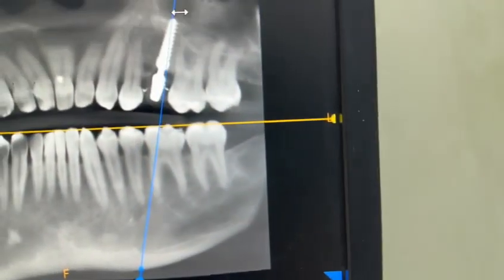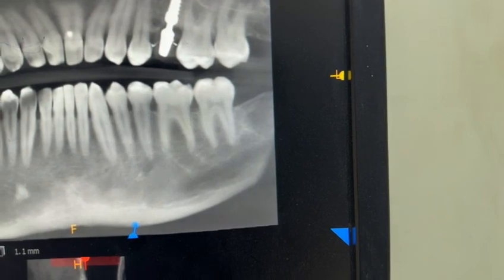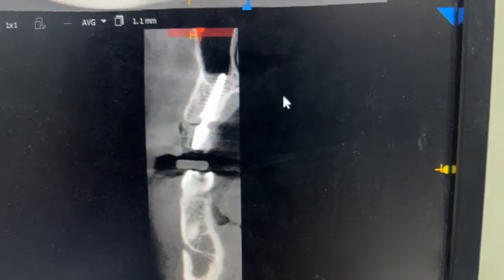The left side still has an acrylic crown. You can see the beautiful healing — see the amount of crestal bone almost covering the neck of the implant. Even the sinus floor is healthy.